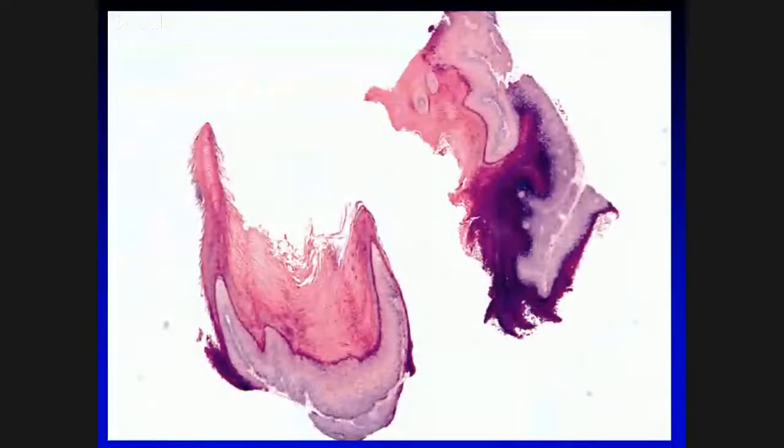We already talked very briefly about the biopsy diagnosis of minimal invasive squamous cancer. So these verrucoid lesions are very exophytic. So when the surgeons take biopsies, they may think they're giving us a lot of tissue, when in fact something like this, you could see there's hardly any submucosa. So that creates, and this is split field from the same case of multiple fragments that were sampled. And as we go to higher magnification, you could see the prominent keratosis. It's in the upper right, it's tangential. The bottom is more appropriately sectioned, but there's no submucosa.